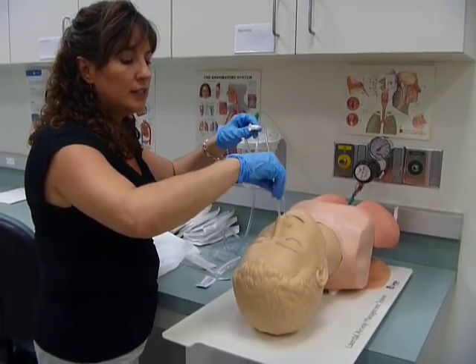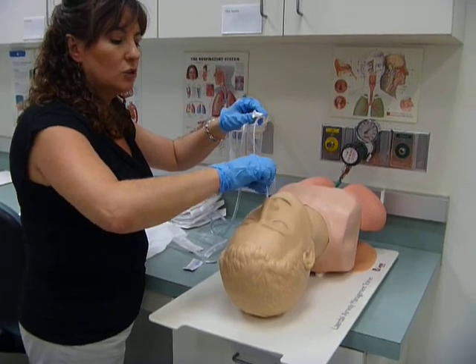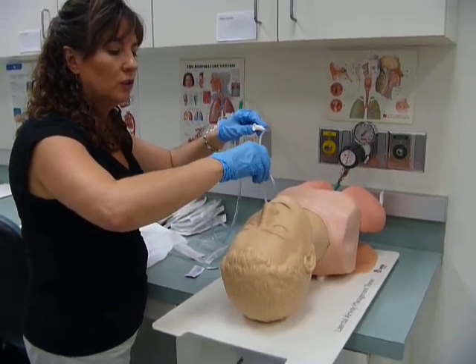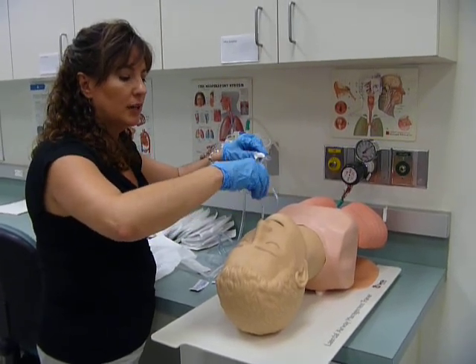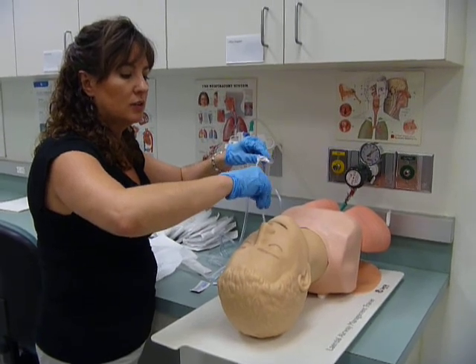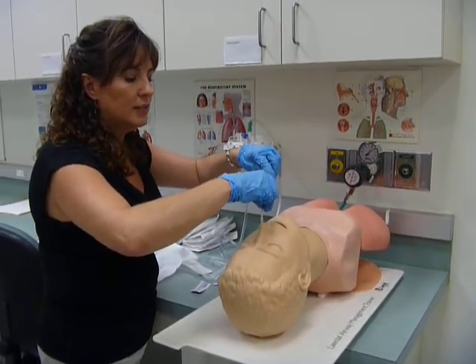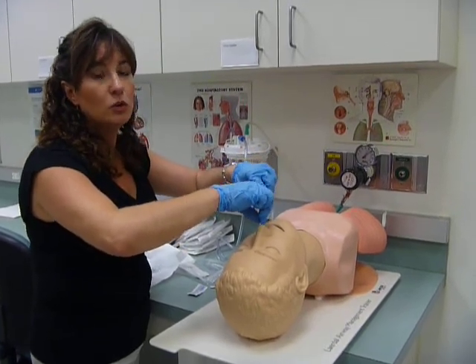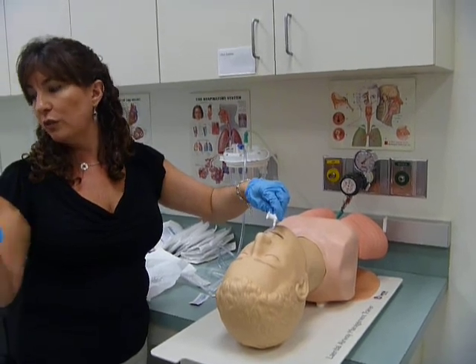The only thing I can touch is the suction catheter itself. Now it's a little more difficult on a mannequin because he's rubber and things don't slide down as smoothly. But you're going to advance it all the way down until either you cannot advance it anymore or you see a cough reflex or feel resistance.